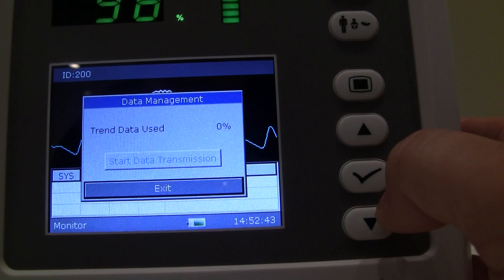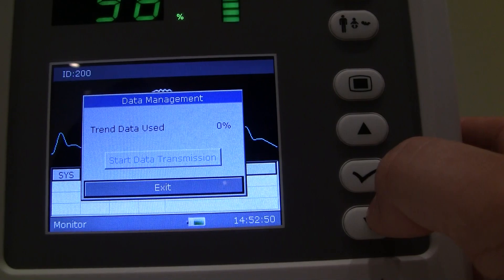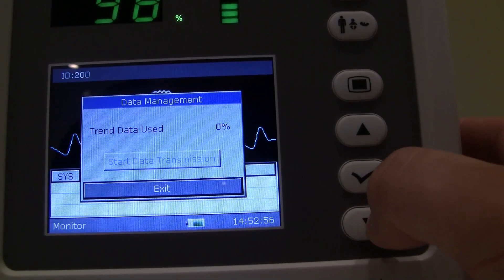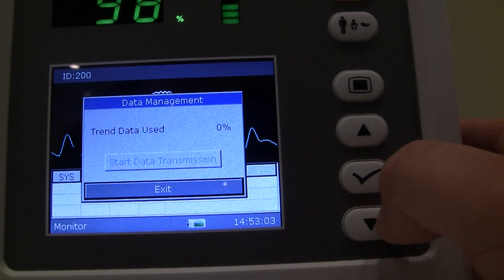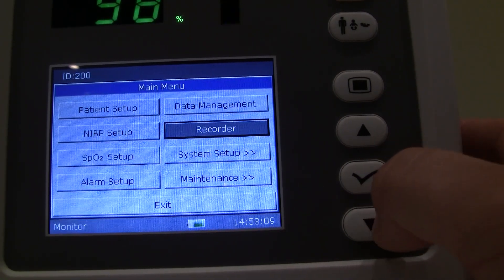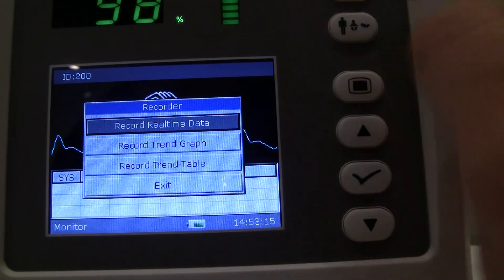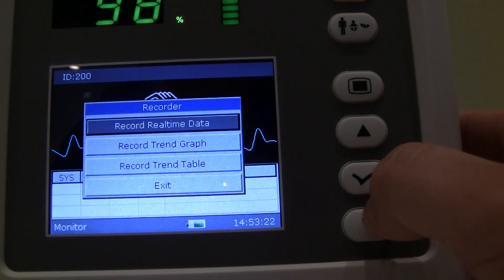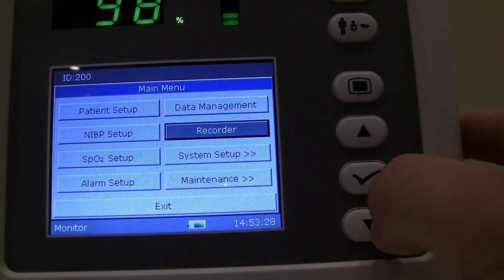Data management is an option. If you have this unit configured, you can easily transmit data to a personal computer where vital signs history and trend data can be captured, stored, and created into various formats including PDF, and uploaded to the patient's electronic medical records if needed. These devices are HL7-based. There is also a central monitoring station currently pending FDA approval. For the recorder — this unit does not have an onboard thermal recorder, but if it did, this is where you would set recording options for real-time data, trend graph data, or trend table data at increments you dictate.